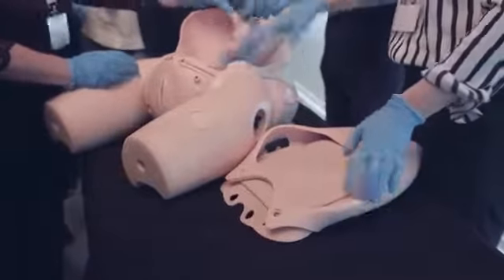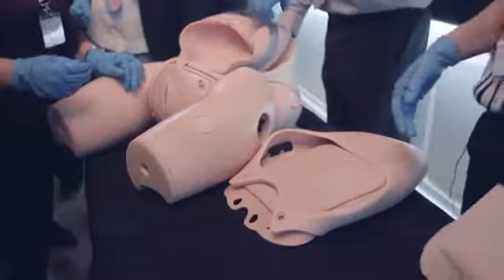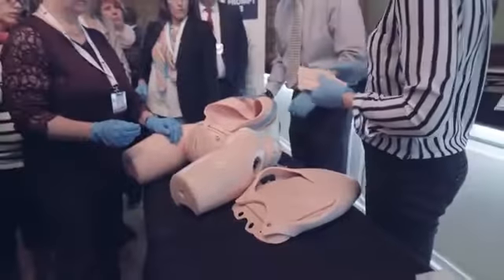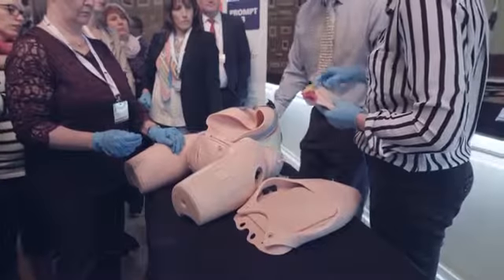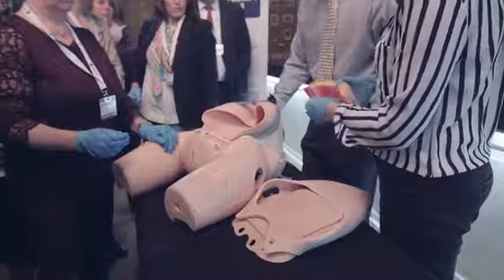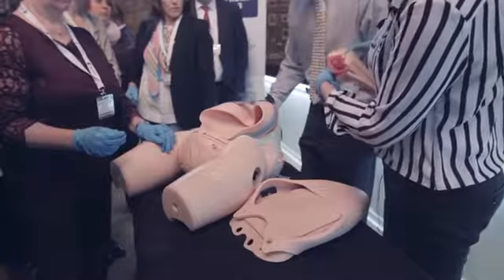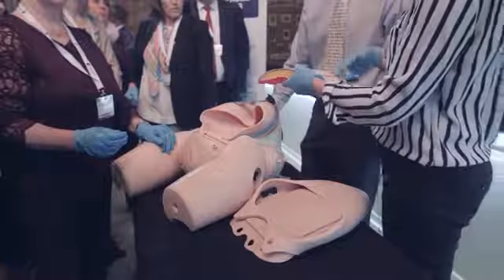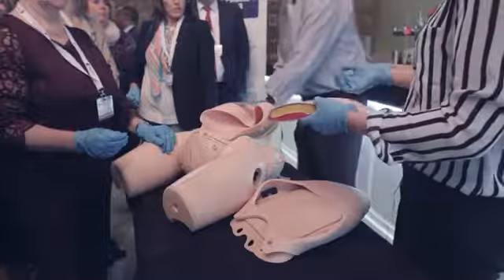So you put that in instead of the skin, and you can just use a normal scalpel to cut through, and it's got the layers. So you've got the skin, cutaneous fat, sheath, rectus muscles, the peritoneum. In here we've got the bladder, the uterus, and then the membranes. So trainees can have an opportunity to practice. It does feel quite realistic.